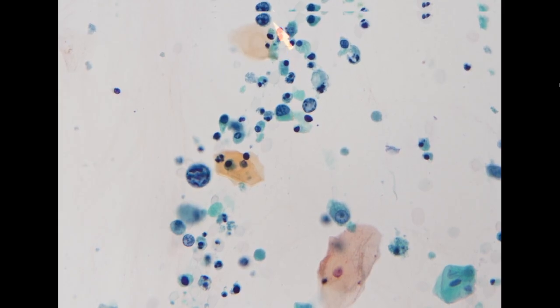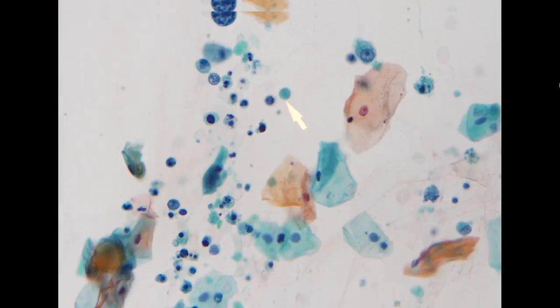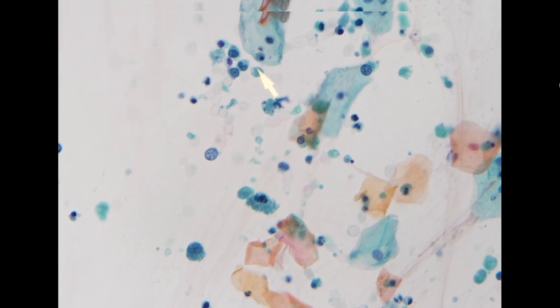However, we can still see a few relatively well-preserved cells with increased NC ratio, coarse chromatin, and hyperchromasia. So in this type of specimen, it is a little bit difficult to determine whether this is truly neoplastic or just because of the degeneration.